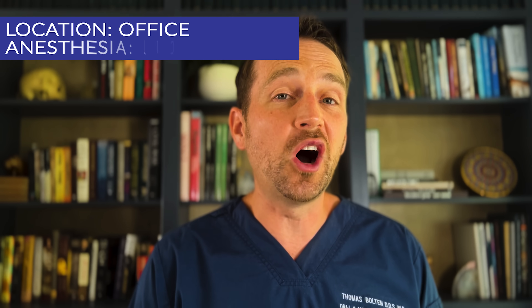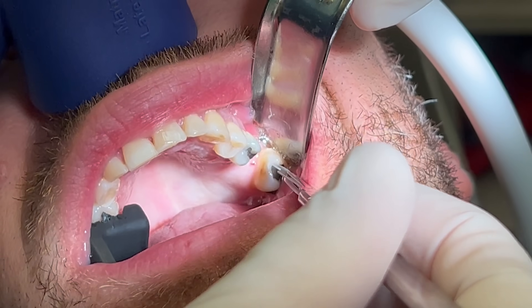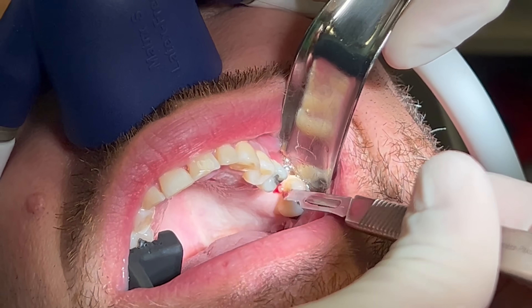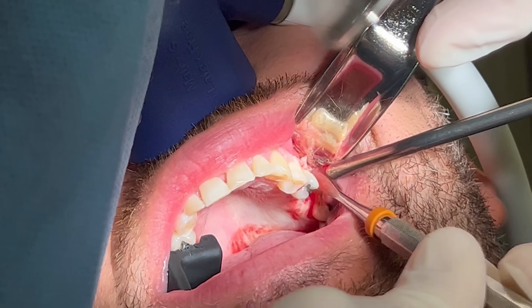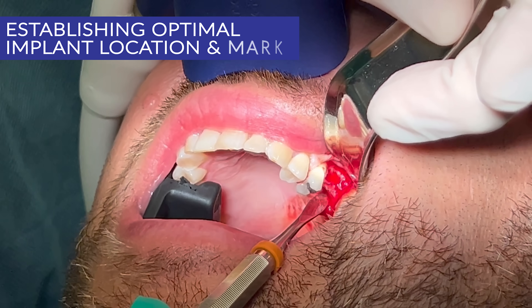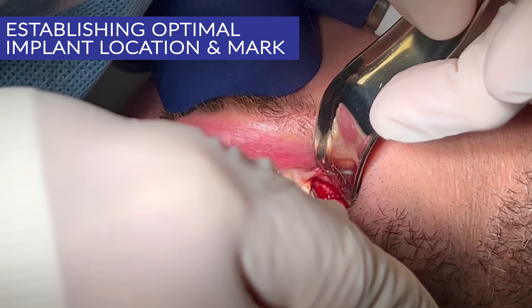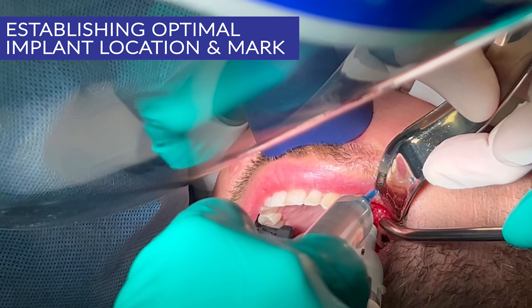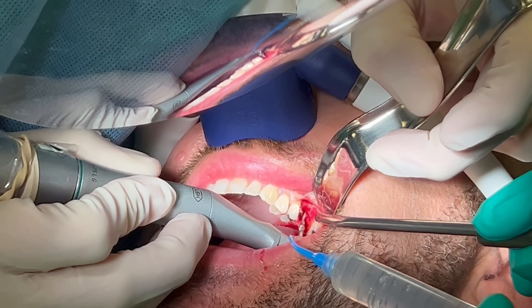This procedure is performed in the office under local anesthesia and nitrous oxide. Once the patient is numb, I make a crestal incision and expose the bone. Next, I use a twist drill to begin the osteotomy.